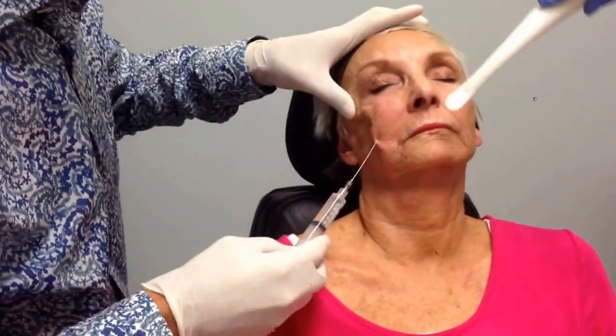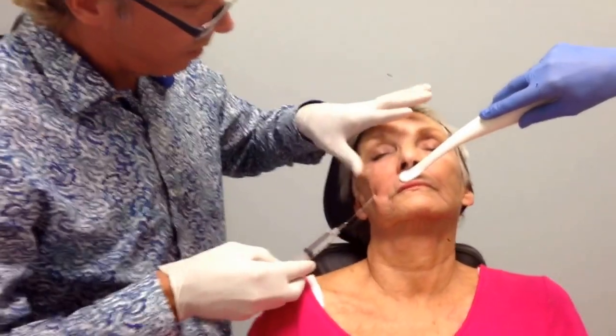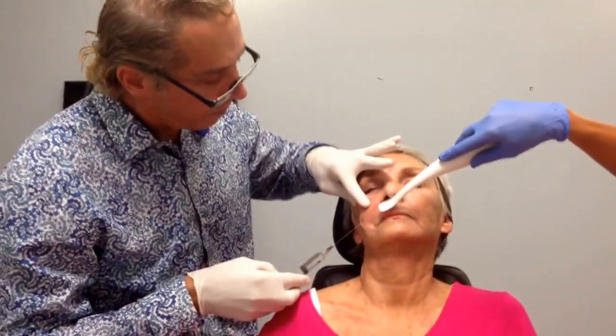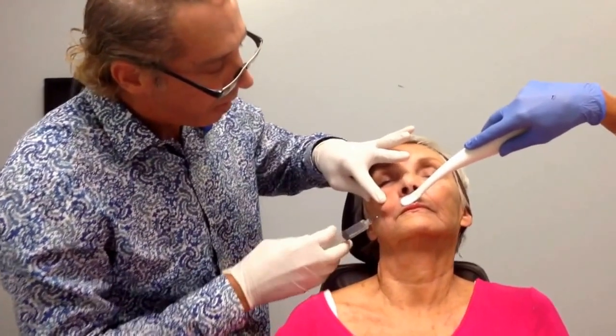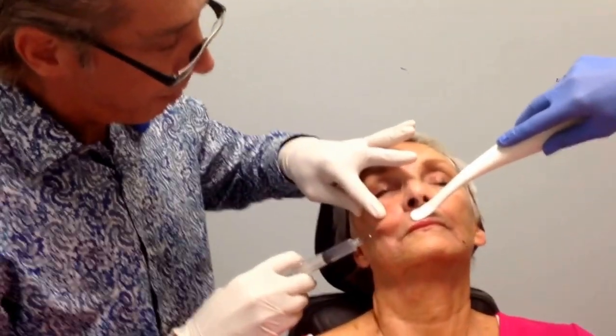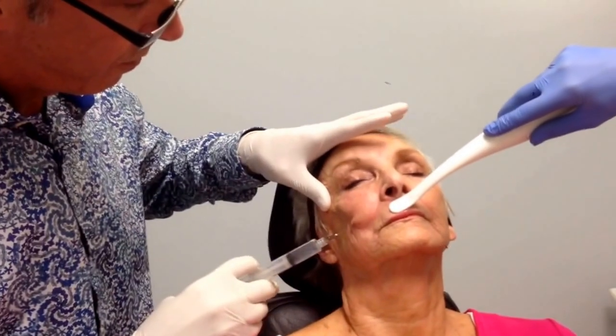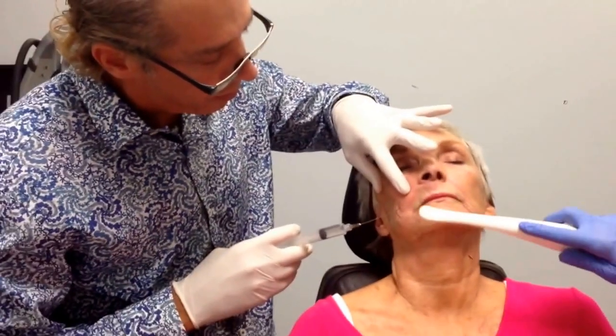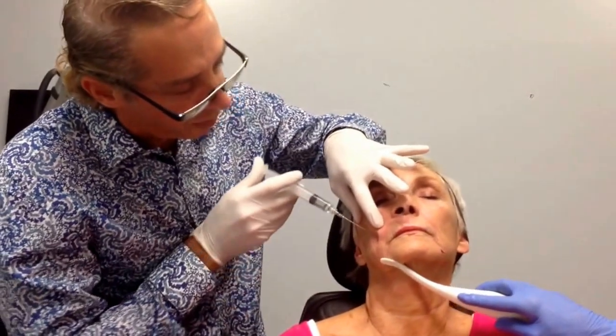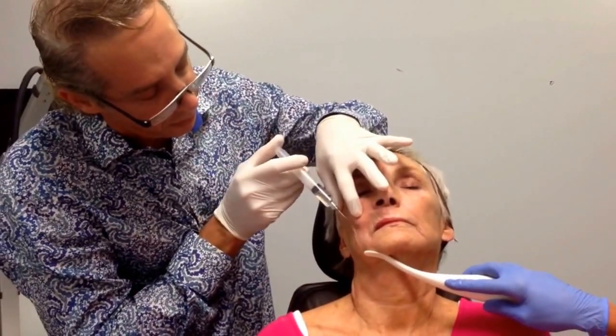And then I come over here and I'm blocking above the lip. And then I come down here and I'm doing the mental nerve. And that should be it.